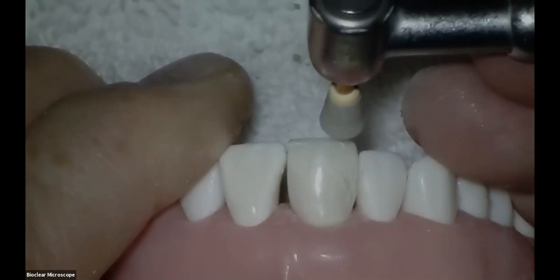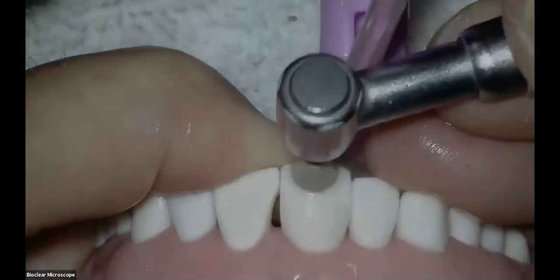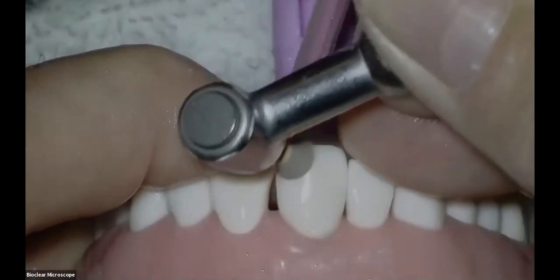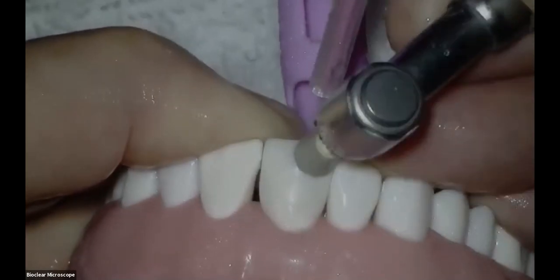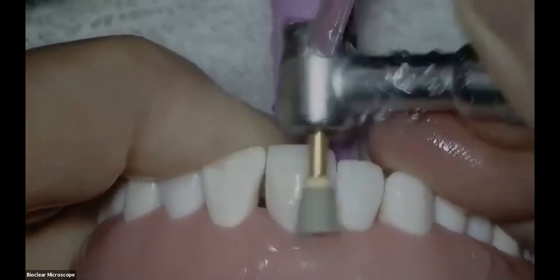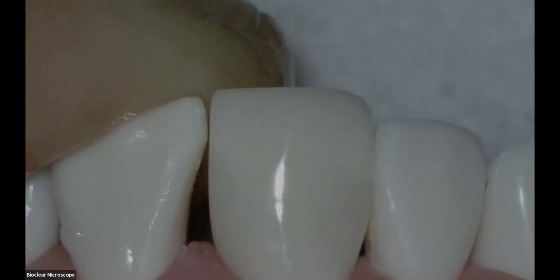Now we're going to stop and move to heavy pressure, about 3 pounds, slow movement and constant air water to cool the tooth. And that is the Rockstar polish.